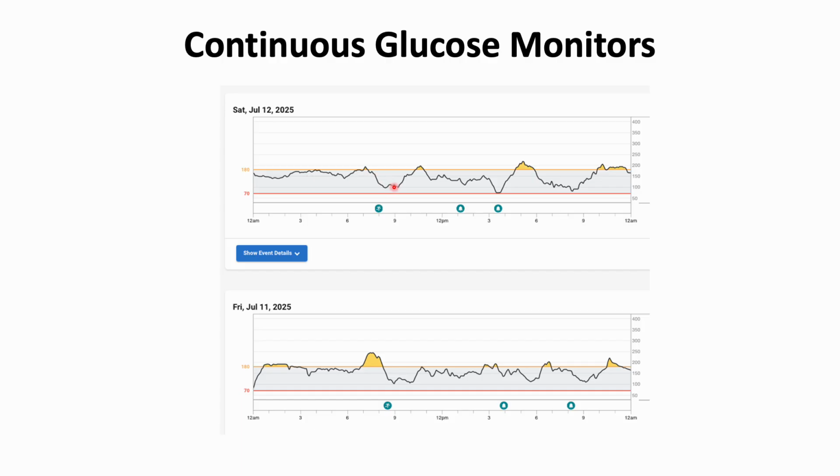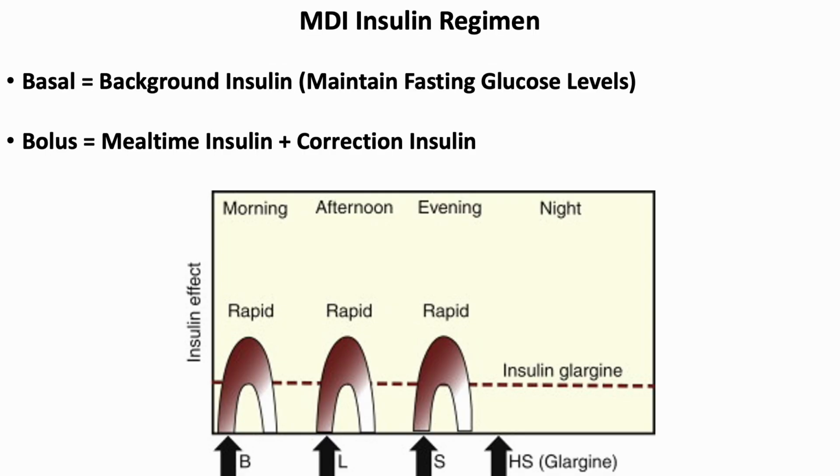Then they've started giving insulin in the morning, they came down, they had lunch, they went higher. So you can really start to dissect out where a patient's struggling with their blood sugars. Is it breakfast, lunch, dinner? Is it overnight? And where do we need to make some changes? So just a wealth of information that allows us to really help patients get their glucose levels to target.